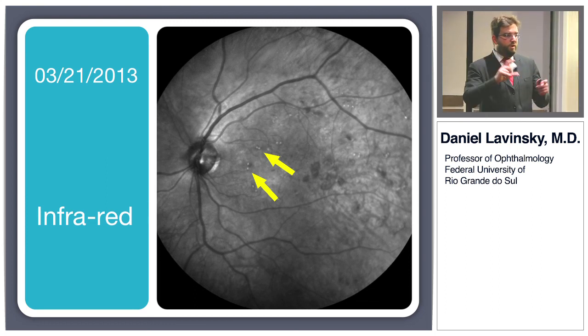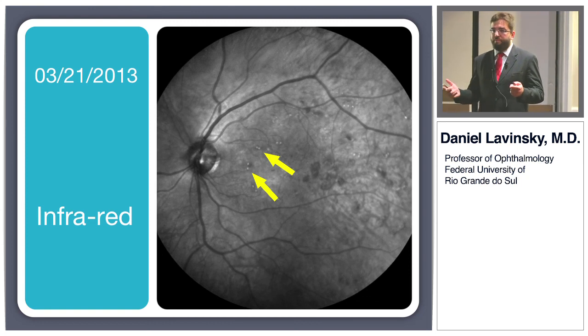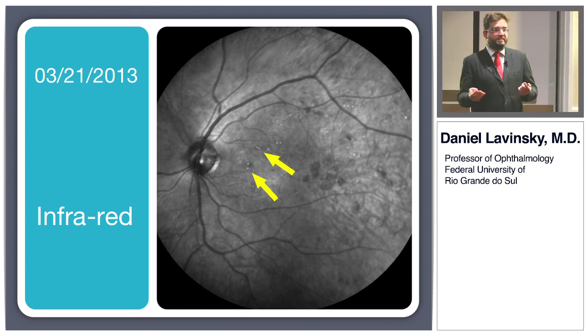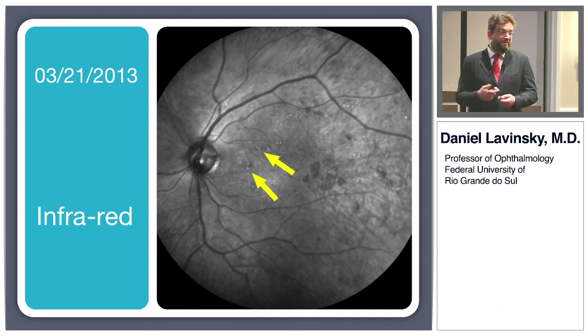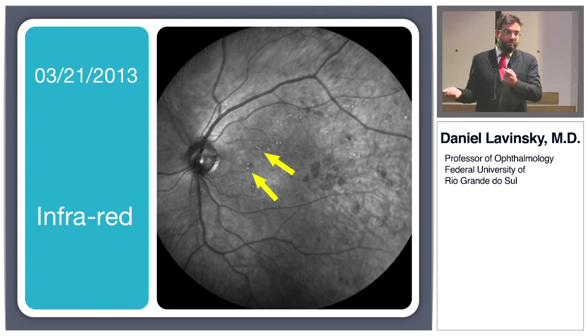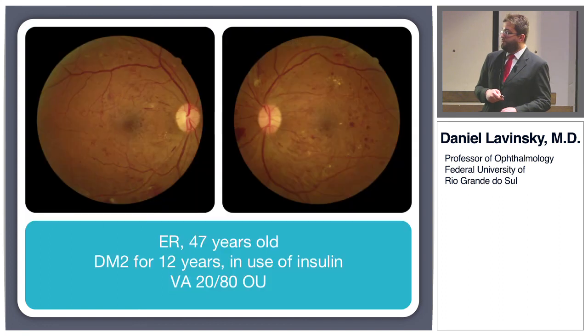But if you want to see where we treated, some physicians, even for legal purposes, or sometimes when they refer to colleagues, they say, no, they didn't treat you with laser, I don't see anything. For these kinds of patients and physicians, maybe having a signature, like a landmark, is good. Clinically it doesn't matter much. If you treat confluently the whole posterior pole, these burns won't affect the result, or even vision.